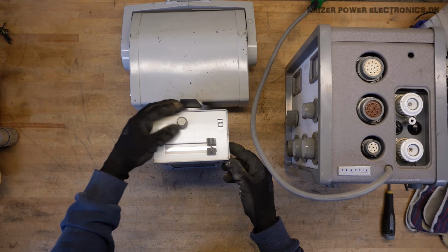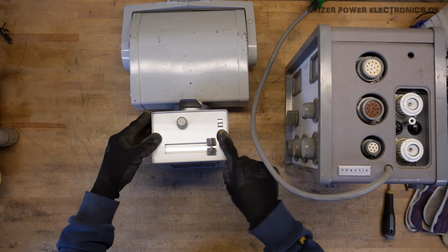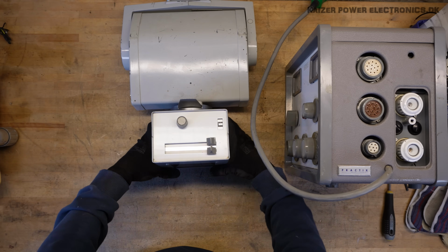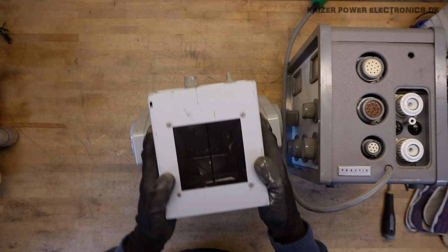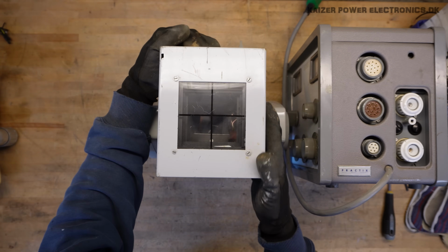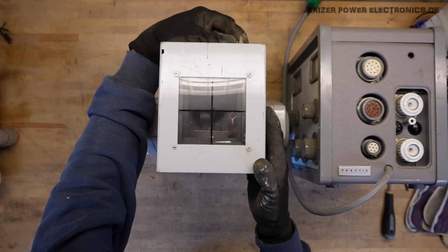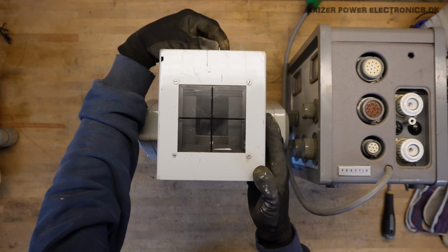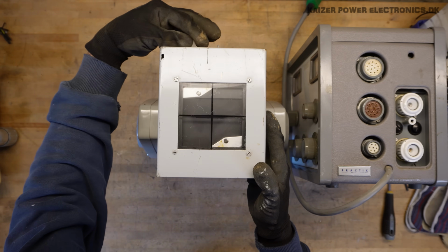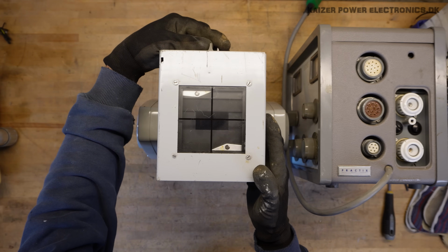weird timer. I'm a bit unsure what that's actually used for. And also some kind of indicator, 100. That could be the 100 kilovolt the tube is rated for. So if we look into the collimator here, we can see that using these sliders we can adjust the aperture of the X-ray image being, or the X-ray exposure. So you don't want to expose humans much more than you need.